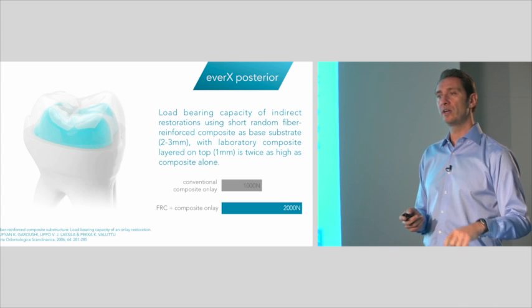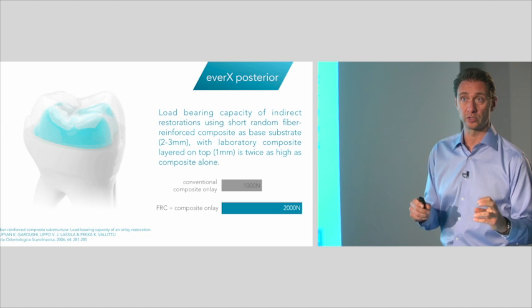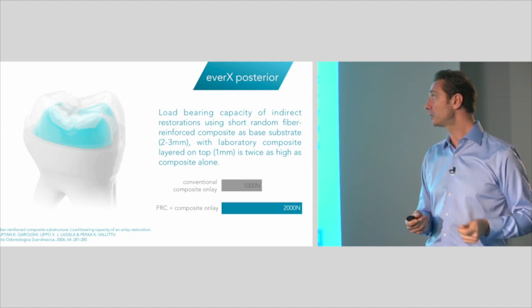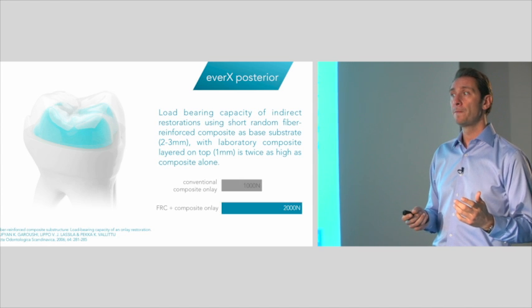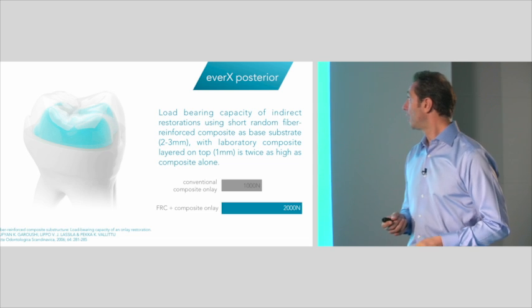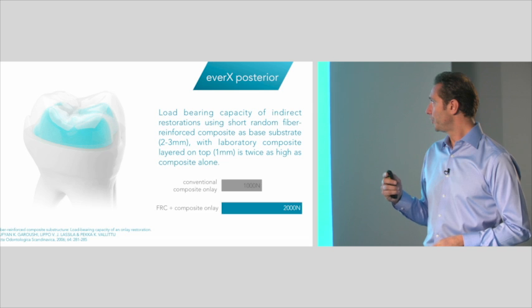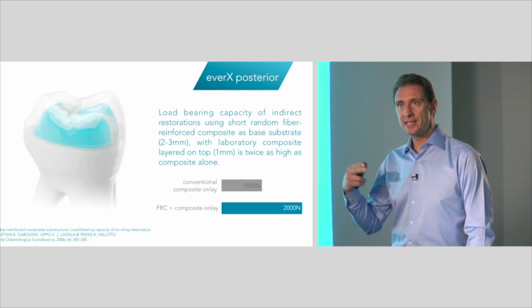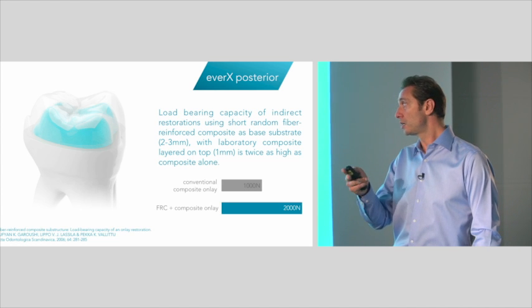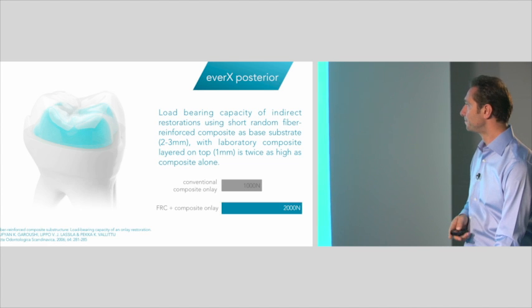Imagine having one restoration that has a fiber reinforced composite as a base, as a framework, and on top of that, already bonded to it, a regular or lab composite. We have the same increase of load-bearing capacity. So it makes sense, both in the direct and the indirect approach, to have a support from fiber reinforced composite underneath.